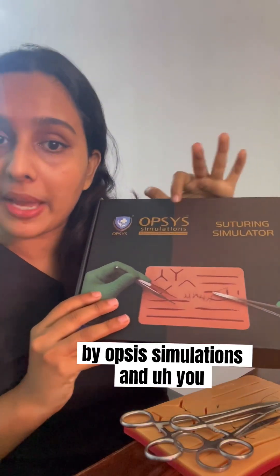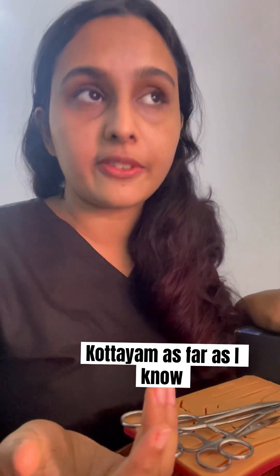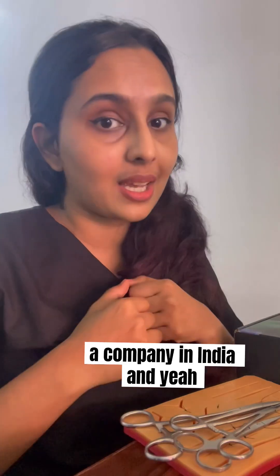So if you're wondering where to get this product, you can search 'suturing simulator by Opsys Simulations' and get it on Amazon. Opsys is a company based out of India, and that is great because it's an Indian company.